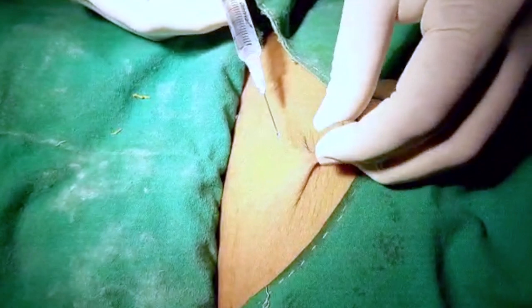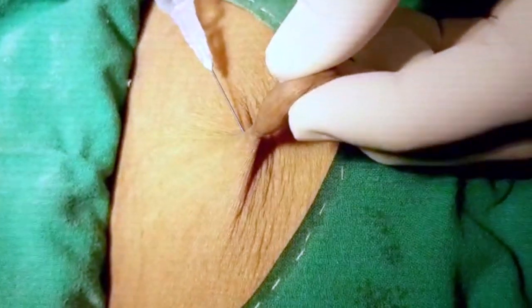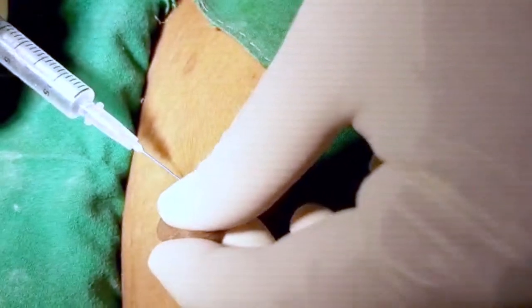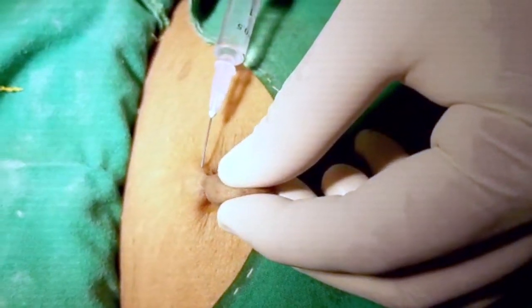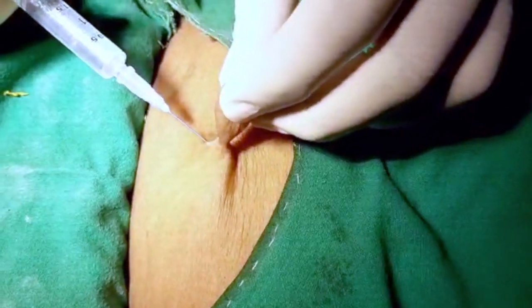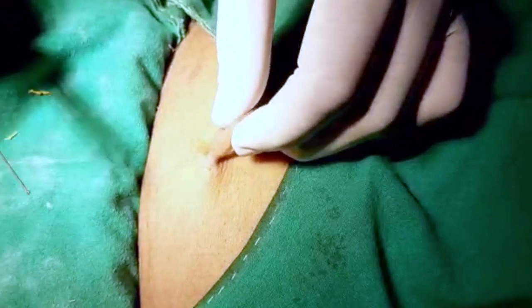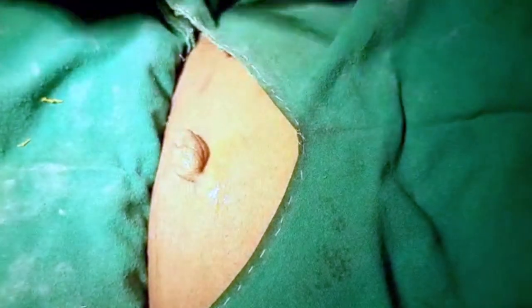Here we will be infiltrating the anaesthesia subcutaneously in all directions with a single prick — we will not take out the needle and will not make multiple pricks. Anaesthesia was infiltrated; hardly 0.5 ml is required. We will wait for some time.